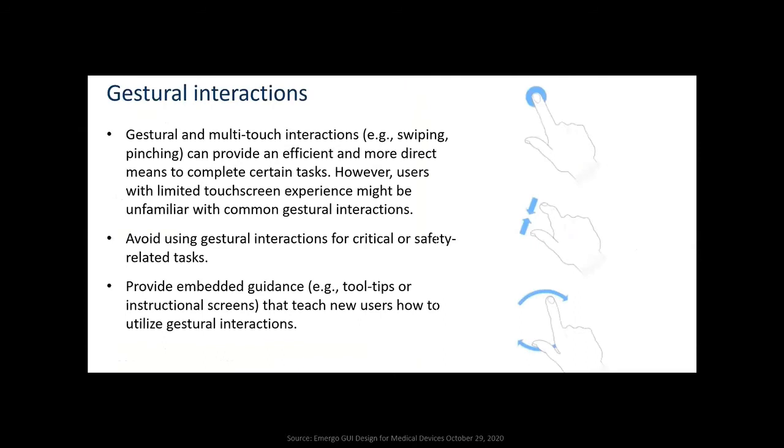Gestural interaction. There's a lot of work being done, particularly in the disability area, with the controls that operate wheelchairs and things, which are gestural movements. Again, you've got to approach this with a bit of apprehension in terms of medical device design. And the thing that wins is the one that works. There's no doubt that this will become more important, but we've got to find a way of engineering it to work properly.